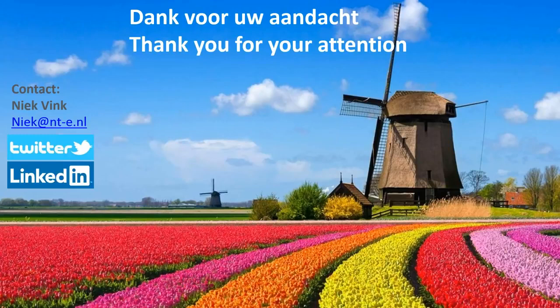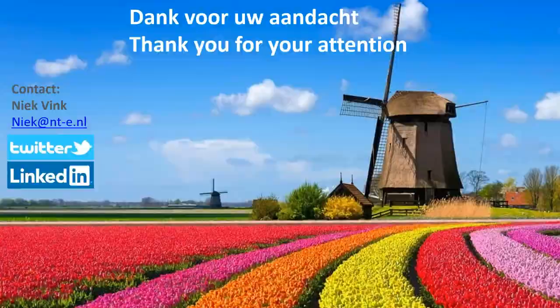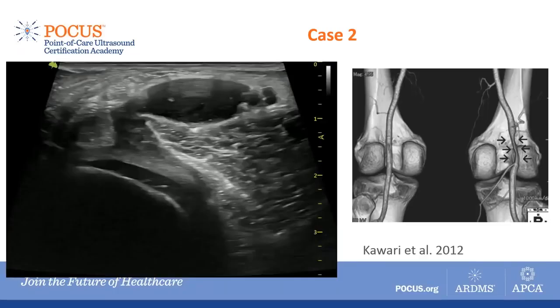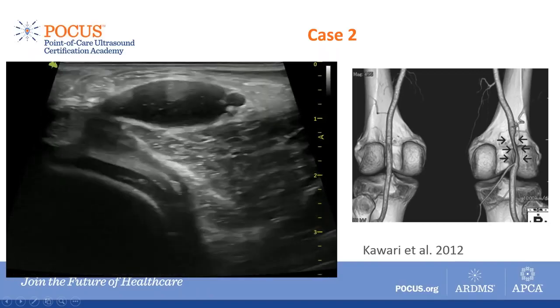That's funny, because these kind of things can happen. You see within the cartilage, you see something. If you can go back to the image, perhaps. I believe it was this image. No, one more back. Yeah, this image. You can see the bony structure of the dorsal cartilage, and within the cartilage you see some hyperechoic structures. And if you see the movie playing, you will see that there's quite a couple of structures within there.